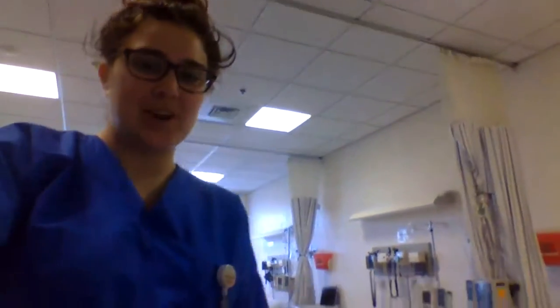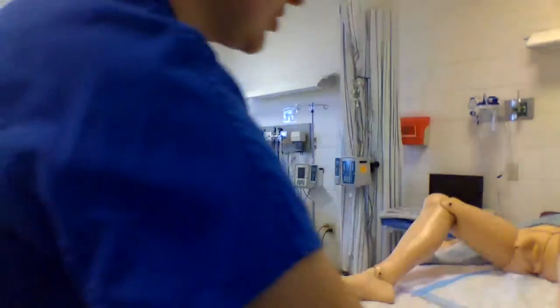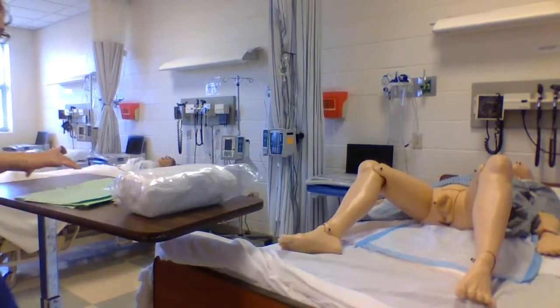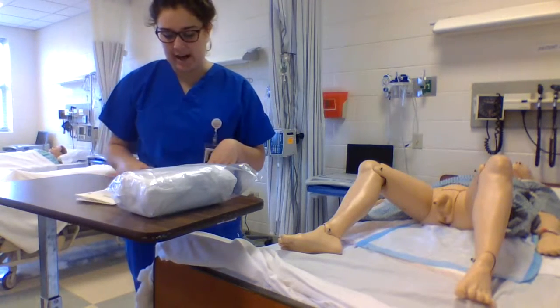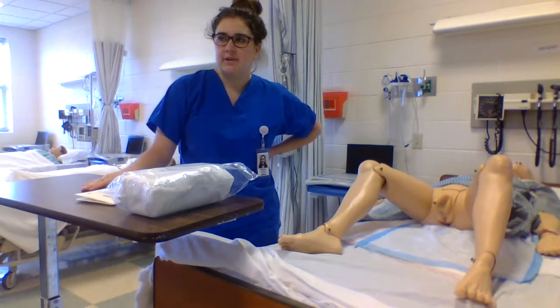I'm going to start off by doing the 12 safety practices, which is verify care order for client, perform hand hygiene before and after client care or handling supplies and equipment. And then also I'm going to verify facility policies and procedures when handling supplies and equipment. I'm going to consult manufacturers' recommendations whenever I handle equipment.